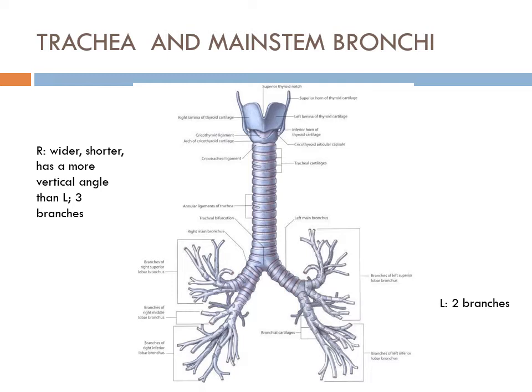You finally get the left double lumen tube in on the left side. And now the patient is being positioned. You're going to turn them on their lateral side. That tube can move, or the surgeon is physically manipulating the airways. So let's say it's a right double lumen tube and they're operating on the right side. Now they're on their left side and operating on the right side, but the tube's on the right side. Again, surgical manipulation is going to physically push the tube out, or you might have back pressures, right?